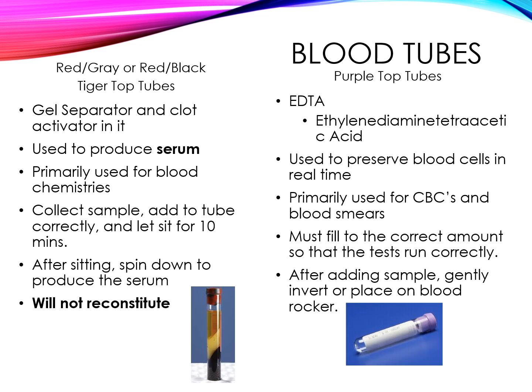Don't ask me to say what EDTA stands for. It's right there. It's a very long word. EDTA is a chemical that is added to the blood to keep it from clotting. So it's an anticoagulant. So blood in purple top tubes is whole blood.